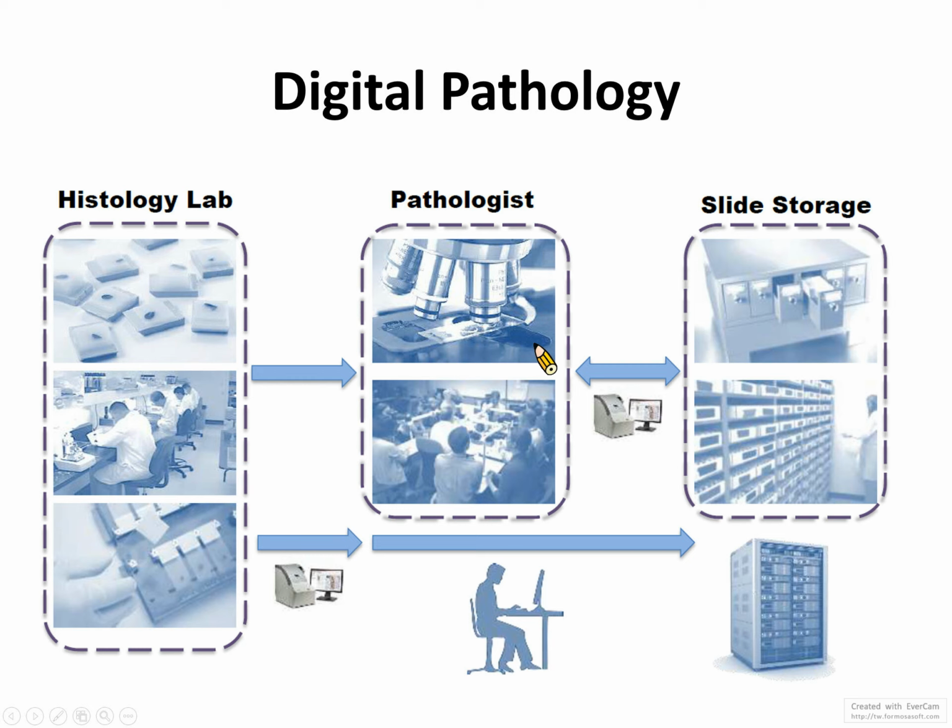So imagine that in the hospital, we cannot discard any pathology slides because those slides are part of the medical records.